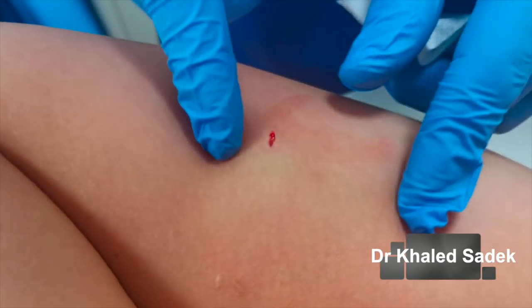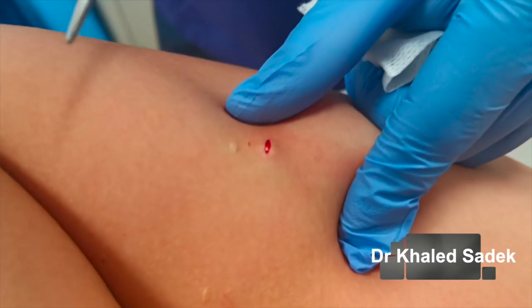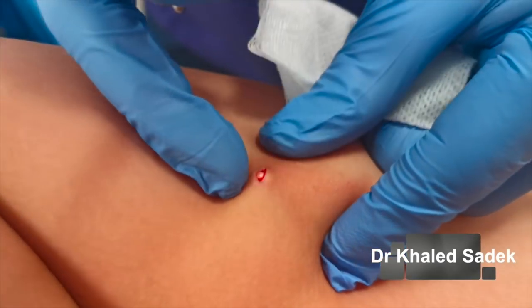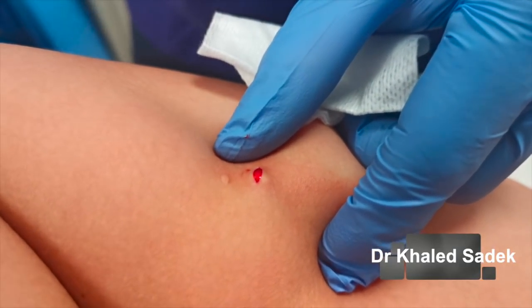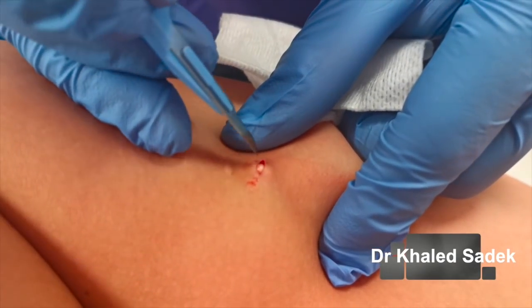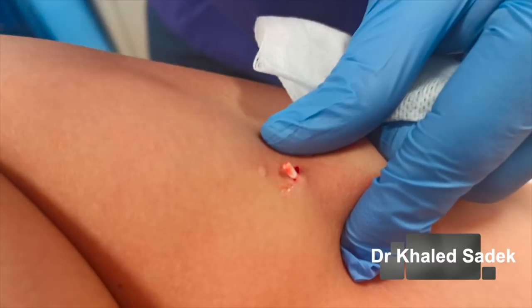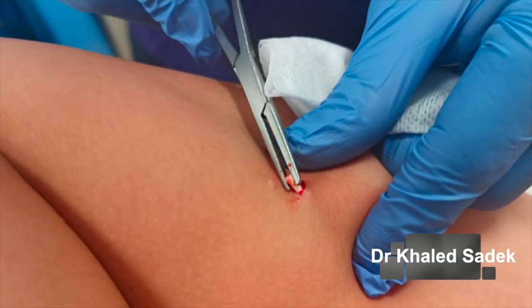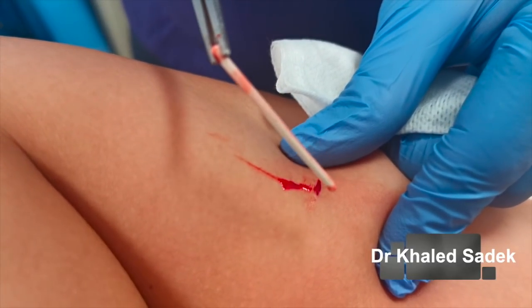So, almost there. We can see the tip of the implant just coming to the surface. Just make a bit of space for it and then just guide it through. Sometimes they need a little bit of a helping hand. There's a lot of poking around, but hopefully no pain. So just release it from its attachments. And there is the implant rearing its head. And just clip it. And out it comes in its entirety there.